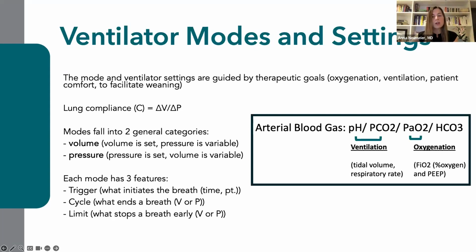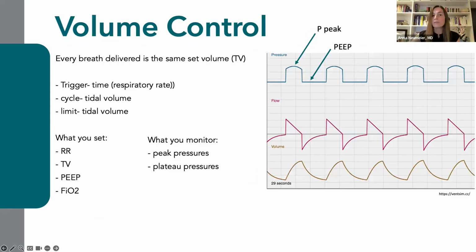As you see, these targets can be reached by either ventilatory mode, and no mode is superior to another. So it's important to understand the pros and the cons of each and what to monitor depending on the mode. So let's discuss volume control in further detail. As a reminder, with volume control, every breath delivered is the same set tidal volume.